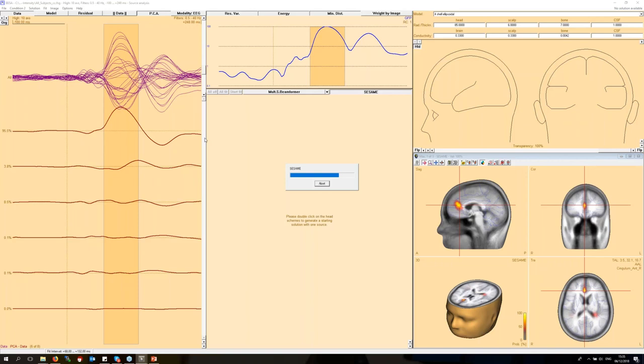So yeah, it just takes a little bit longer, but we can see quite nicely that it seems to home in on this anterior cortex and also seems to keep the sources that we saw in the auditory lateralized areas too. Yeah, we'll take another few seconds here, I think.